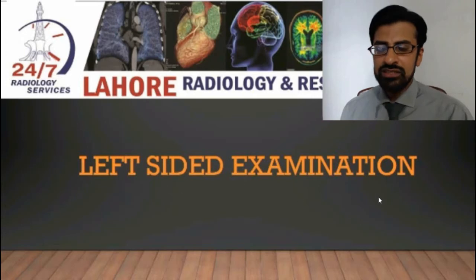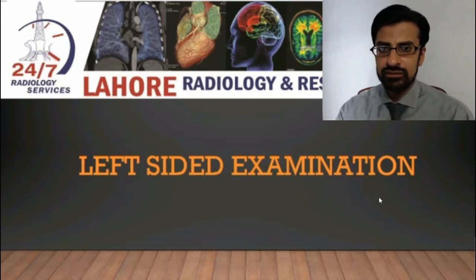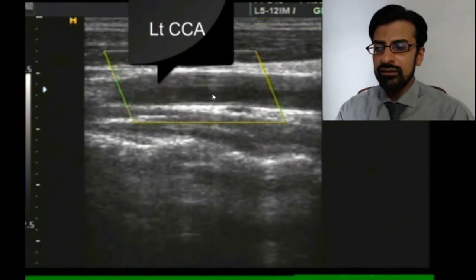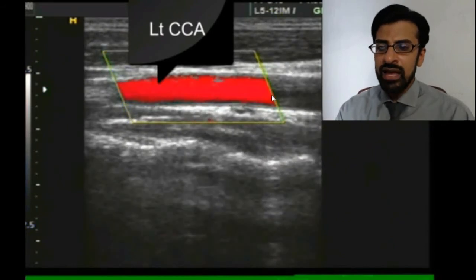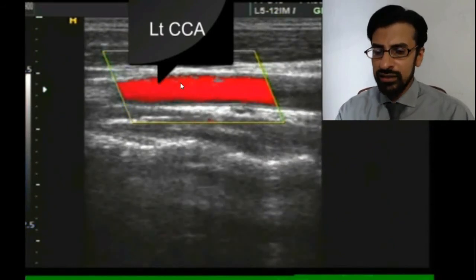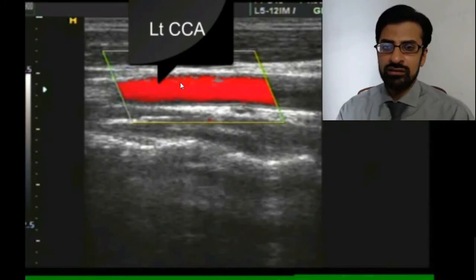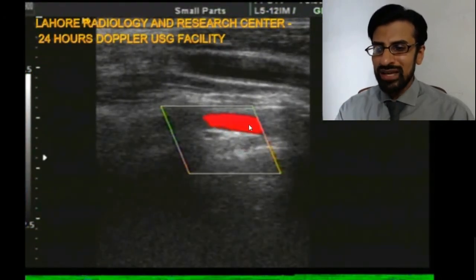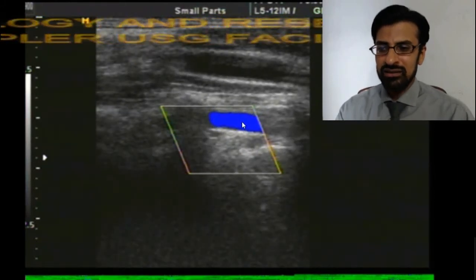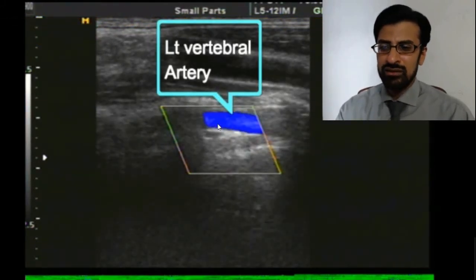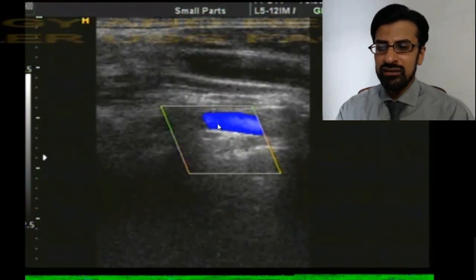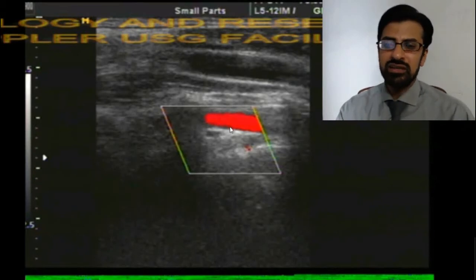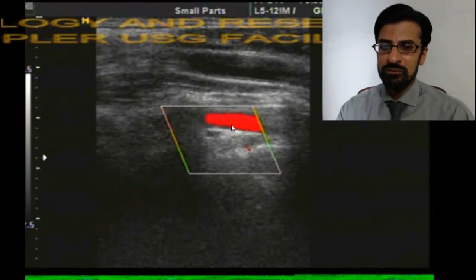Then we started examination on the left side of the neck. We traced the left-sided common carotid artery — it showed a normal color as well as spectral pattern. The left-sided internal and external carotid arteries were also normal. Then we traced the left vertebral artery. You can well appreciate that within the vertebral artery there is alternating red and blue color. This alternating red and blue color means there is a to-and-fro movement of blood within the vertebral artery, which suggested the presence of subclavian steal syndrome.